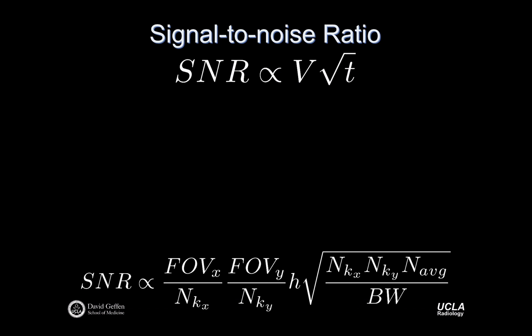What's the difference between fat and water? What's an important difference about fat and water at all? In what way are they different? Chemical shift. So what does that mean? So fat has a chemical shift relative to water. What does that actually mean if it's shifted? Its Larmor frequency is different, because of the molecules. Yeah.